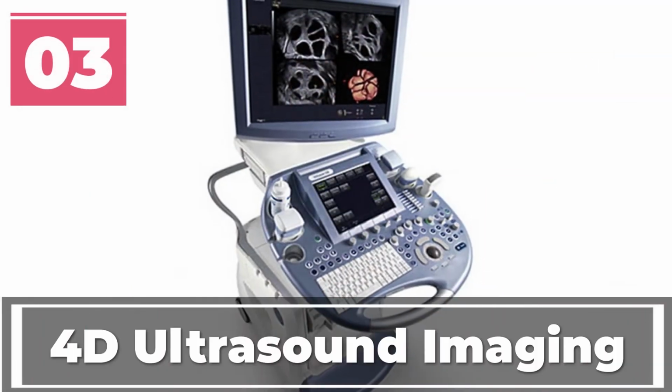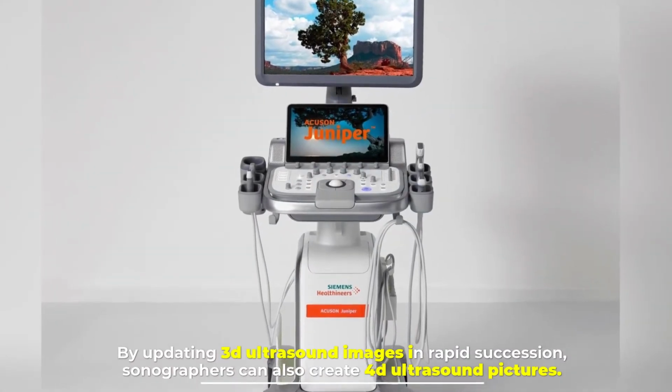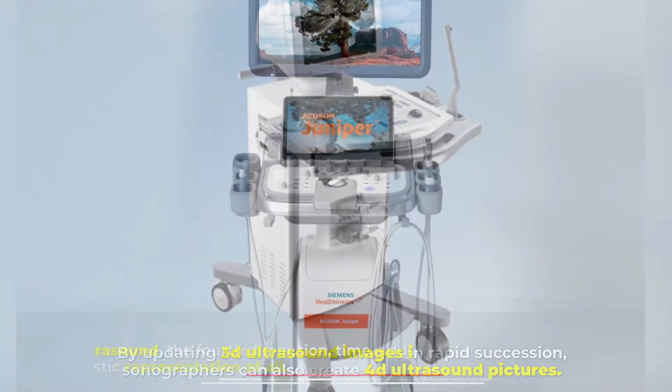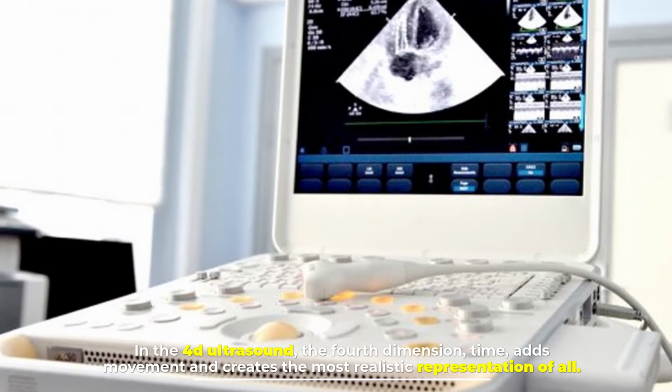Number 3. 4D ultrasound imaging. By updating 3D ultrasound images in rapid succession, sonographers can also create 4D ultrasound pictures. In the 4D ultrasound, the fourth dimension, time, adds movement and creates the most realistic representation of all.